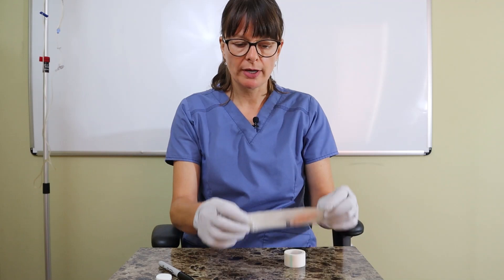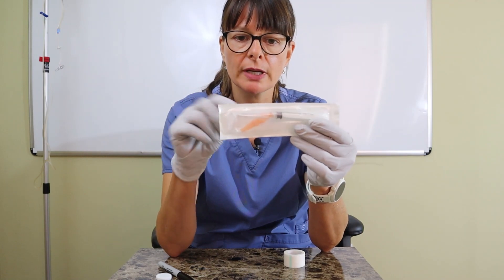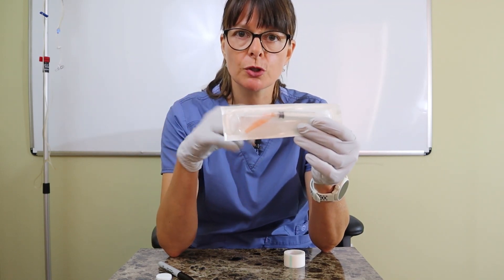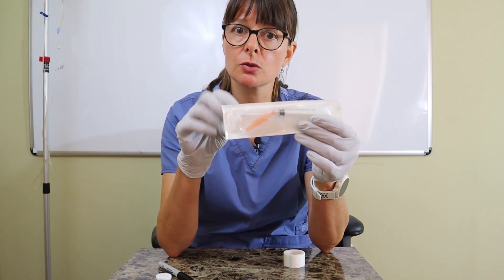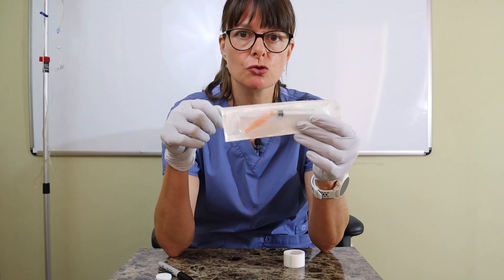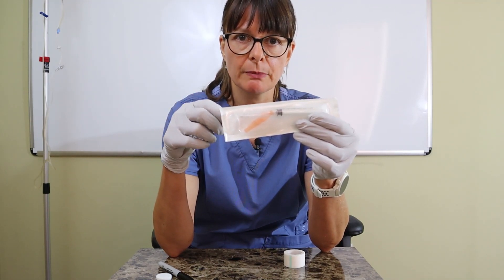In this case, I need to draw up 2 mls, so a 3 milliliter syringe is definitely appropriate. This syringe already comes with a needle attached. If I only had the syringe, I would need to either attach a needle, or use a medication straw or a needleless system to draw it out of the vial.